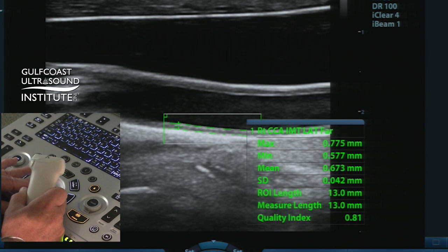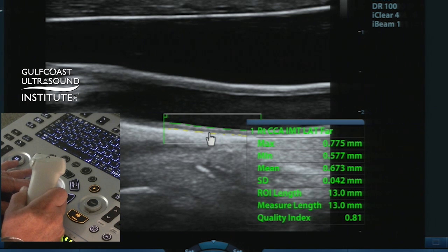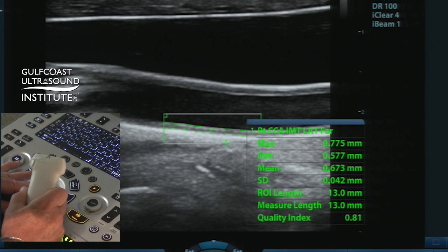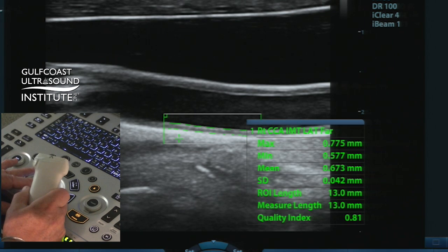You can see right here along these lines, an indication of the quality. It follows the intima-media thickness layer very well. The lumen-intima interface and the adventitia interface are relatively smooth — they're followed very nicely. There's no evidence of points of data dropout.